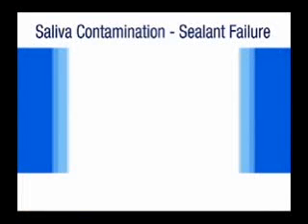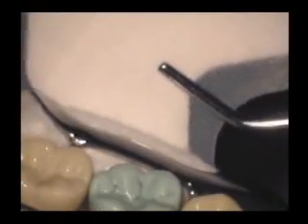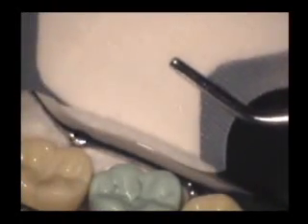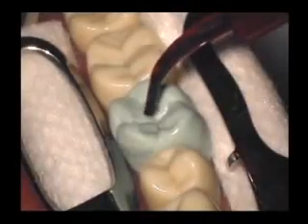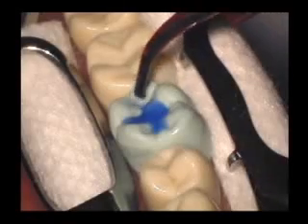Sealant failures occur most often with saliva contamination. Appropriate cotton roll isolation provides the same protection as that provided by rubber dam. Use of a triangular-shaped absorbent buccal shield provides additional protection when placed over the parotid papilla and salivary duct in the cheek. Etching the tooth prior to applying sealant provides optimal conditioning of both dentin and enamel.